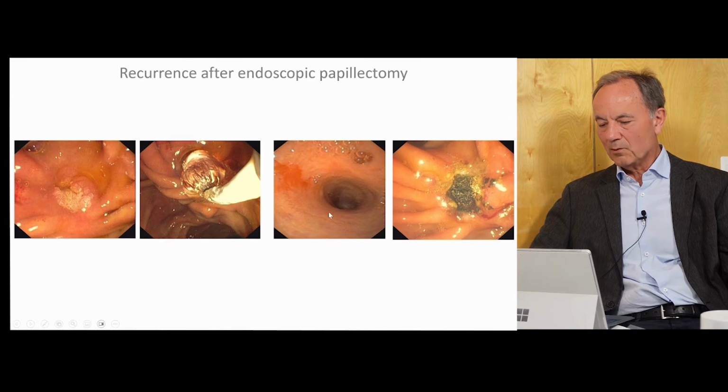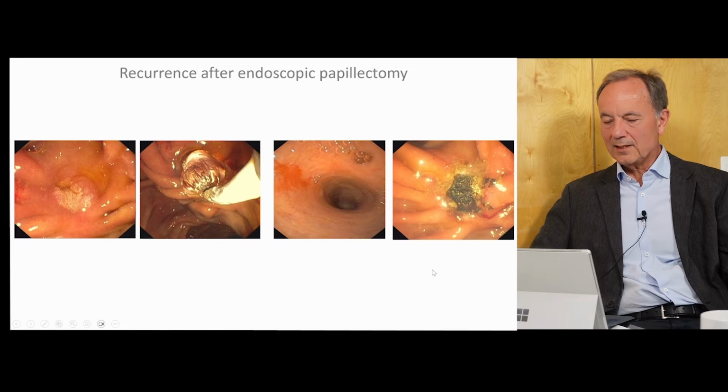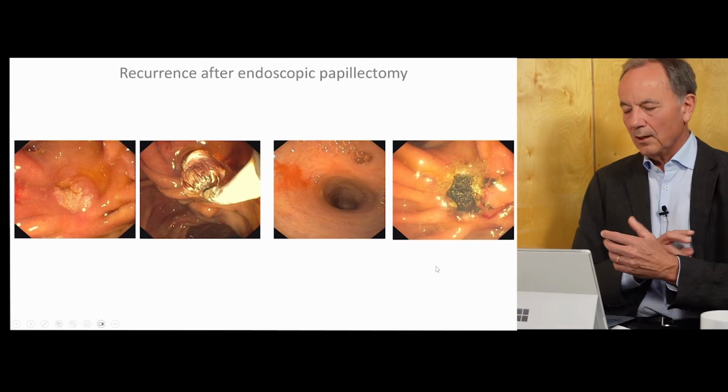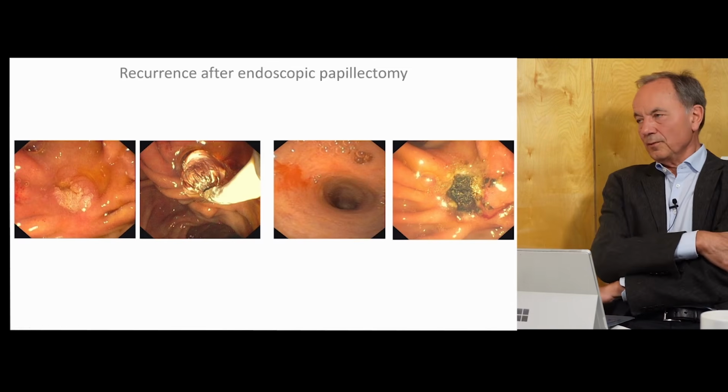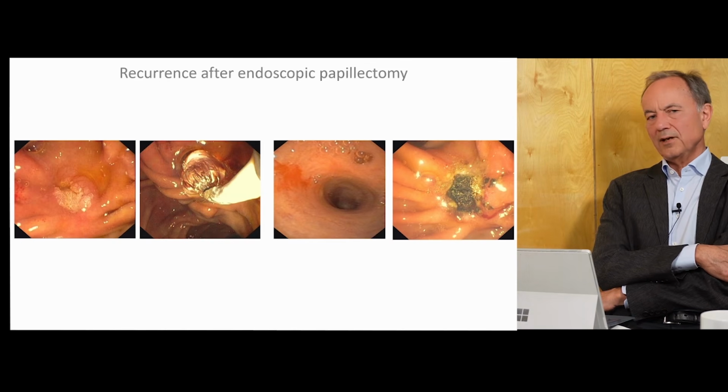Here we even combine it with cholangioscopy to exclude a deeper ductal infiltration, and the patient had recurrence again, and we used electrocoagulation. So these are the techniques. Of course, radiofrequency ablation is another option. Shows quite promising results. So for those who have an infiltration of max of 1 centimeter, especially in younger patients, those with deeper invasion than 1 centimeter should usually undergo surgery.